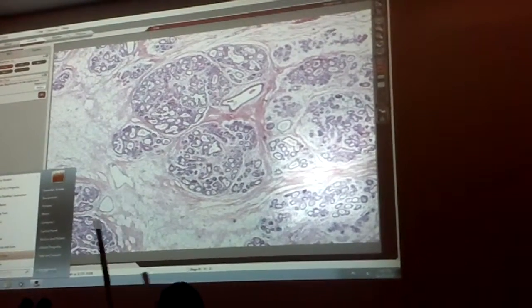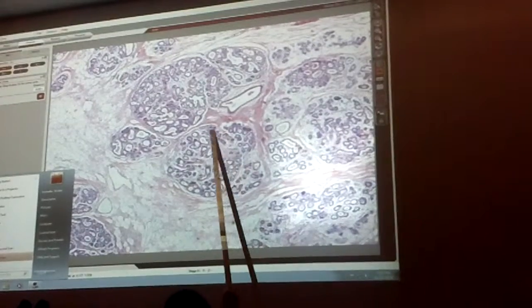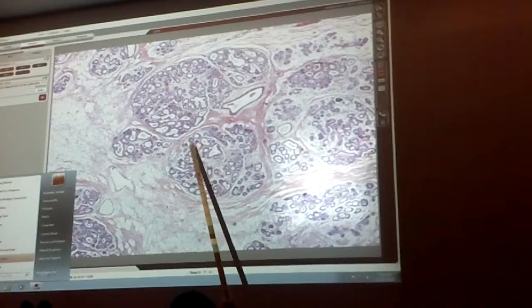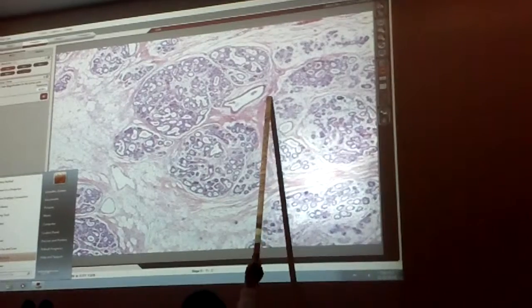Looking for was a lactiferous duct that was kind of all by itself, right? That's what we said we'd ask it. So lactiferous duct here, the area is the lobule, all of that. Individual things, glandular alveoli. Here's some adipose. And then all of this in here, that interlobular connective tissue.